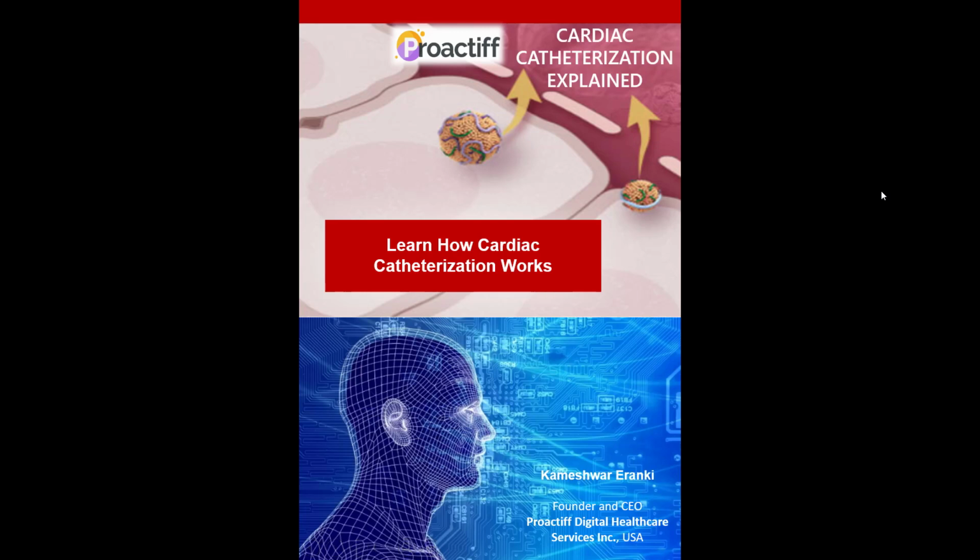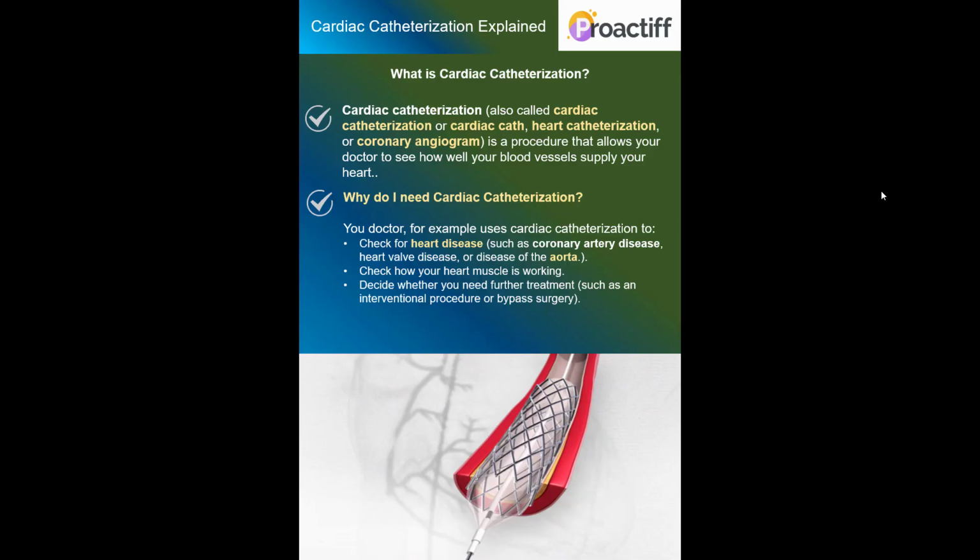In this session, we're going to cover the topic of cardiac catheterization and learn how it works. What is cardiac catheterization? Cardiac catheterization, also referred to as cardiac cath, heart catheterization or coronary angiogram, is a medical procedure that allows your doctor to see how well your blood vessels supply the heart.